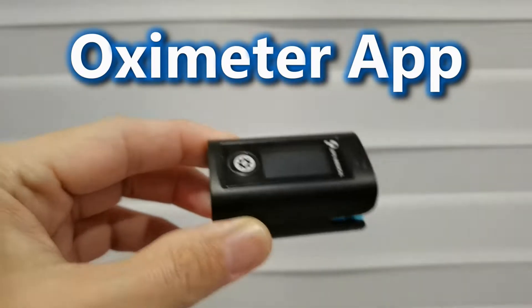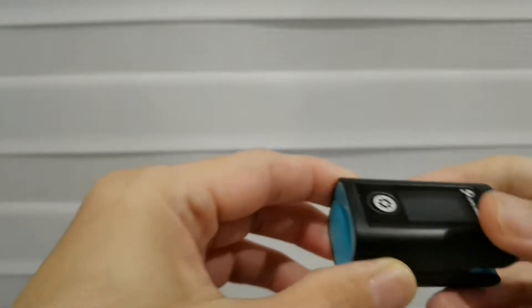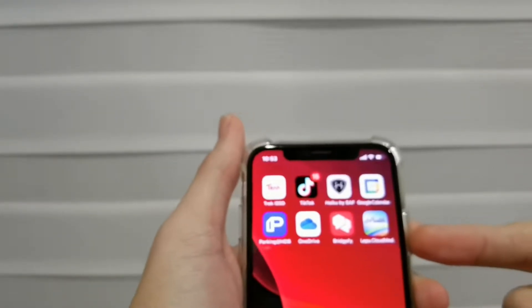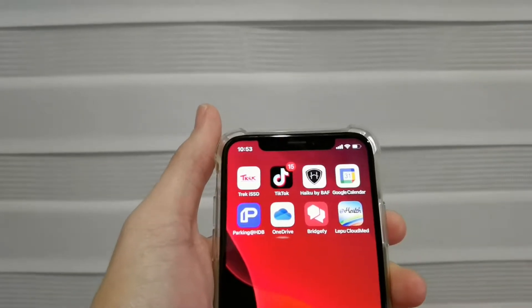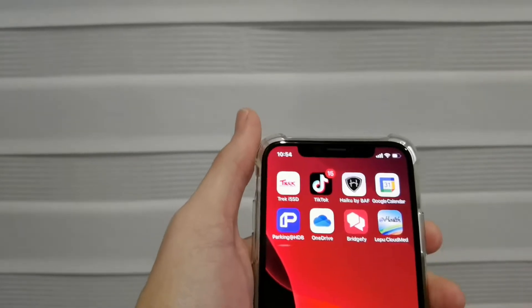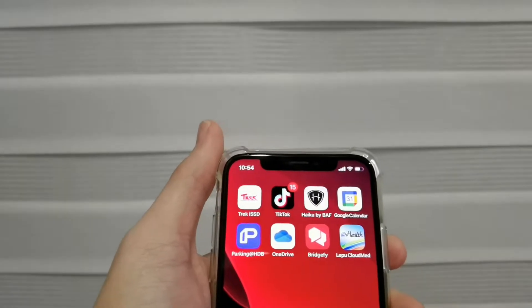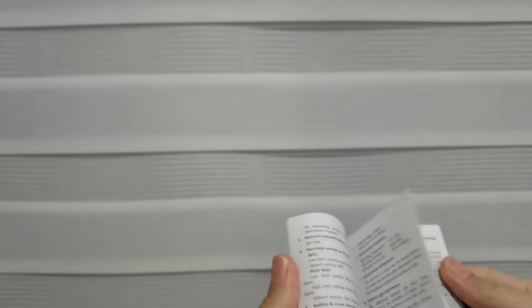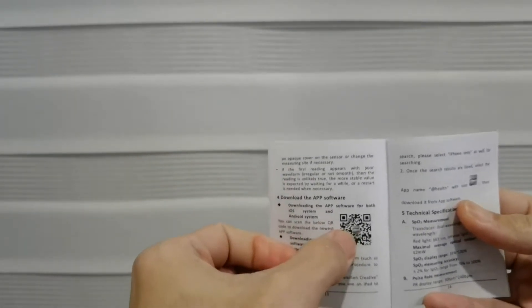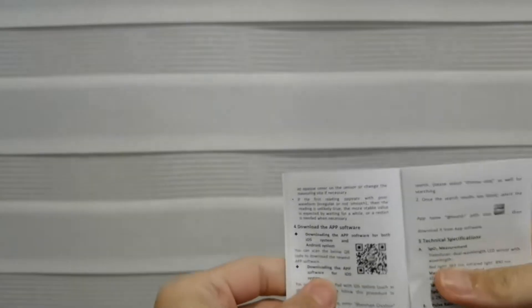I tried to find it on Android but I couldn't, and finally I found it using the Apple App Store. I downloaded this app. You can go to the manual and use the QR code to scan it — just scan it and you can get this app.